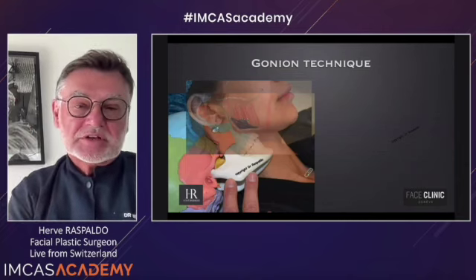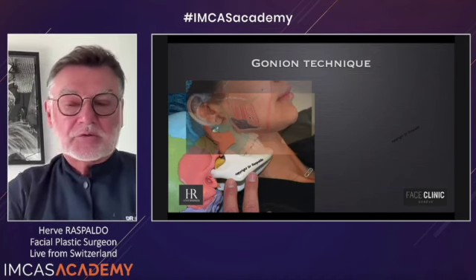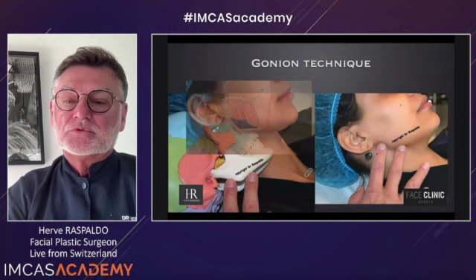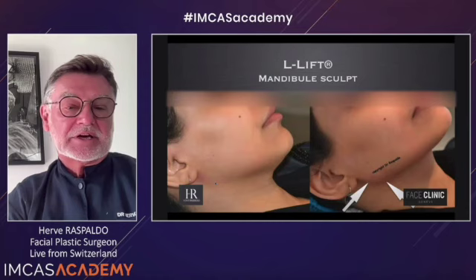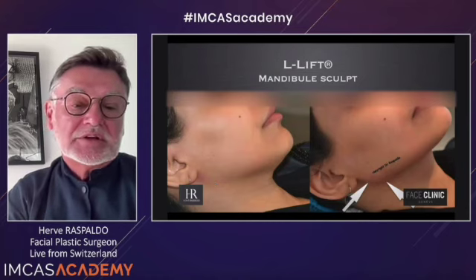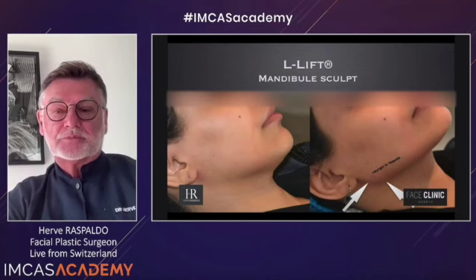In the past, I was injecting in the masseter. The problem, if you inject in the masseter, then when you chew and you bite, the product goes away quickly. And this is the way to do it. You wear gloves, you use the antiseptic, and then you inject between your 2 fingers. And this is the immediate result with 1 cc. And you see the light and shadow, there is only a white, the skin, there is no limitation. And now you have a limitation and an angle. That was one of my first cases 10 years ago.